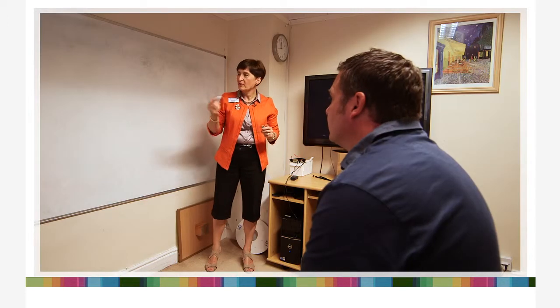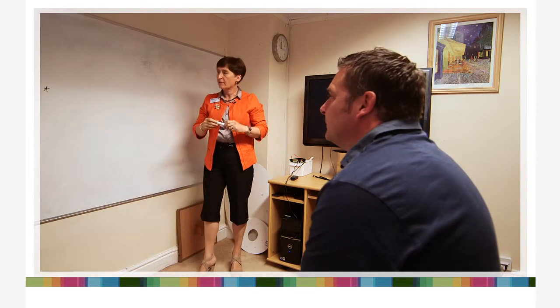A friend came to see me about 12 months ago, having had a stroke, and this had taken the right half of his vision, which was quite devastating. Okay, well, we've done this before, but what I'm going to do is ask you to look at that mark there, and we want to find out the extent of the seeing area to the non-seeing area.